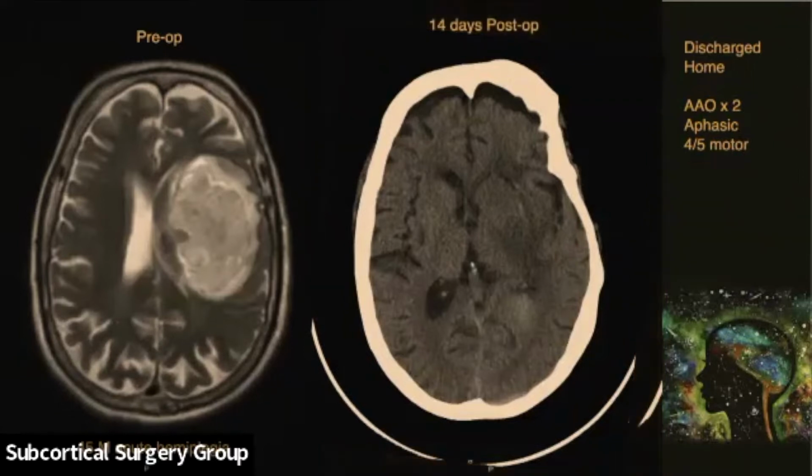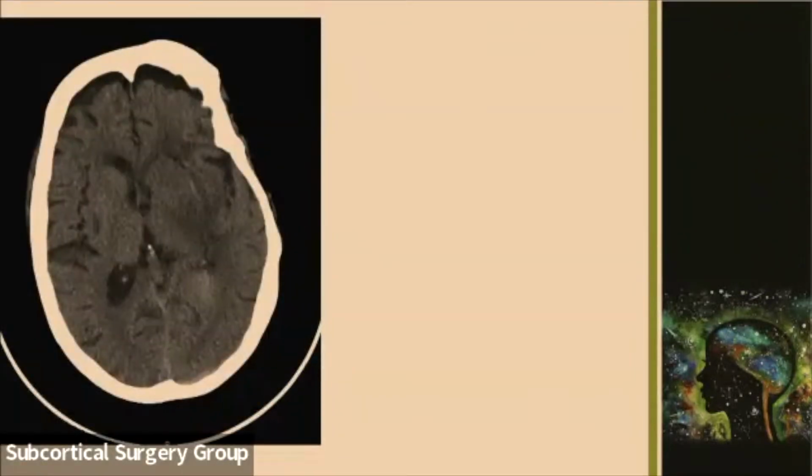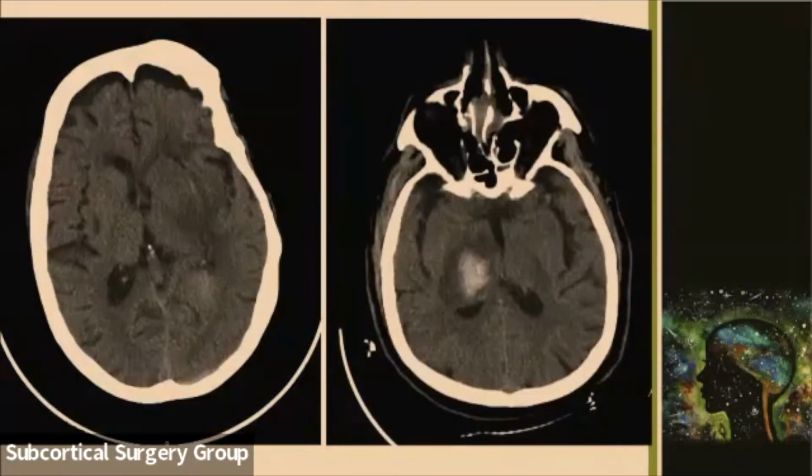So I am interested in the edema in and around these lesions because I know that this edema, which is 2 weeks after the initial hemorrhage, this shadow here on CT, in many cases represents necrotic brain tissue, which when resected, if you were to take out that hematoma, which you wouldn't, but if you were, there would be a lot of difficulty with control of bleeding because the surrounding tissue is already necrotic.